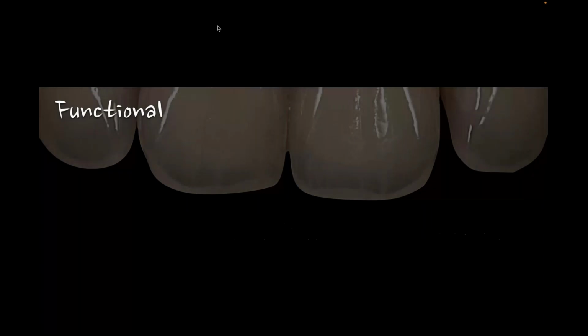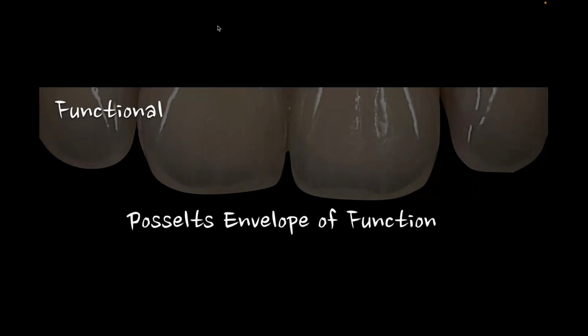So in the past, the way we worked through it was first functionally. For me, when I look at an incisal edge, before I'm thinking about aesthetics, I'm always thinking about the functionality of the position of the incisal edge. And I want to make sure that whatever we're doing restoratively is going to stay there restoratively. So for all of us, I think we have to be much more cognizant of this, in the sense that a doctor sends us a case, they ask for 4, 6, 8 veneers, we make the veneers, and then 6 months later something breaks and it's back on us. Why? What material did you use? Was it strong enough? Now I need a harder material.